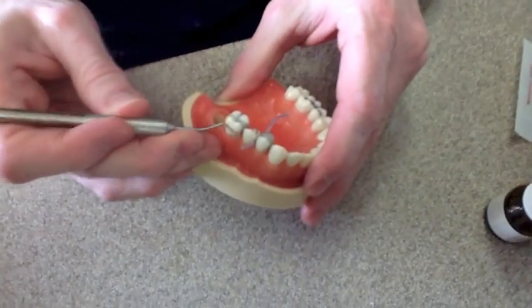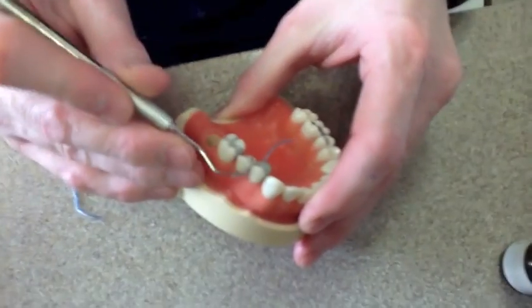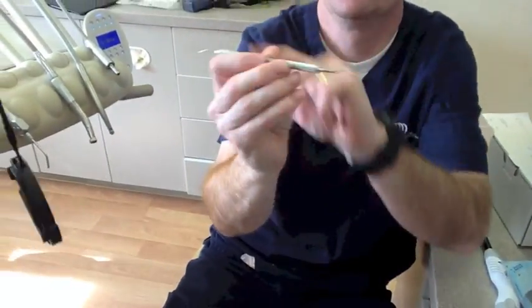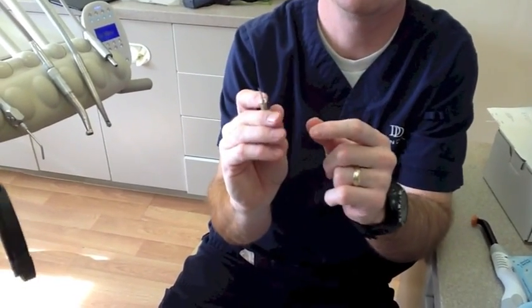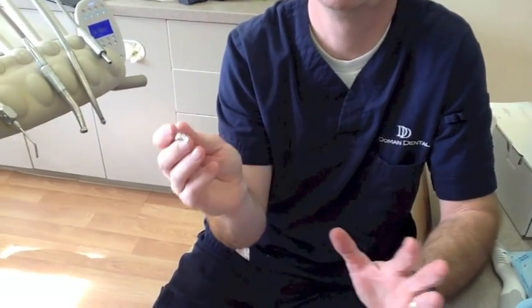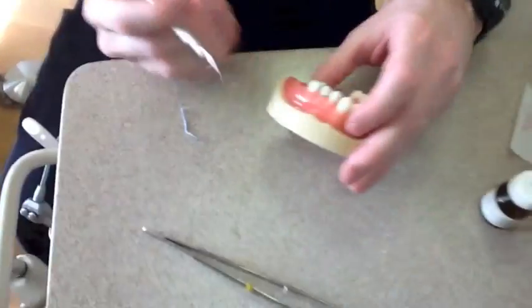So come on in. I'll show you what I mean by all this. It's not about how hard I push down in there. It really is about... Oh, let me show you this tool again. This tool has different angles on these. So if you're working with this one and you can't find the right angle, switch it. You'll find it with this one. Between those two, you can always find the right angle. Okay, so come on back.